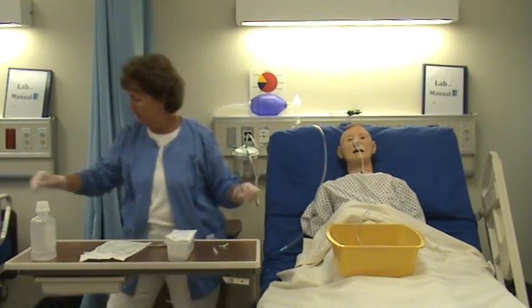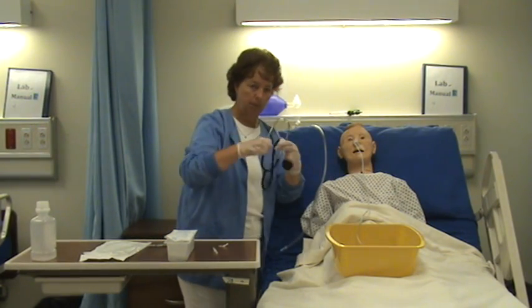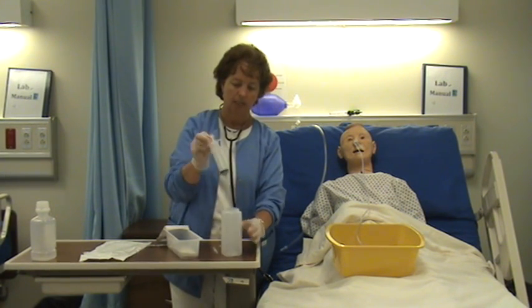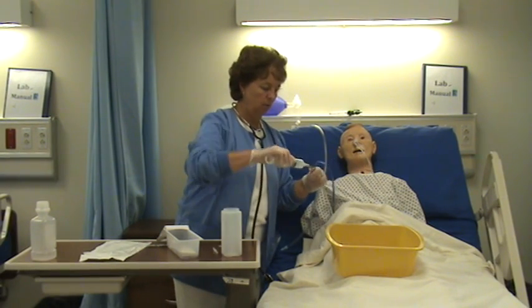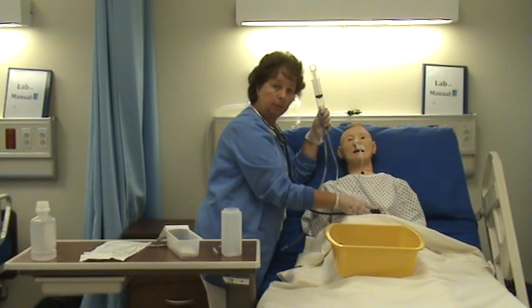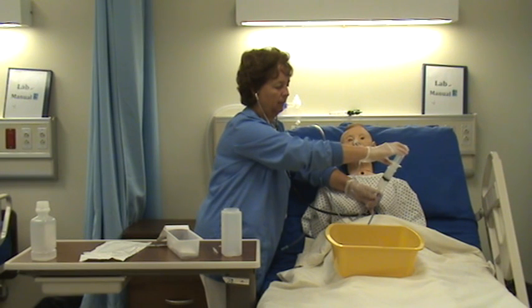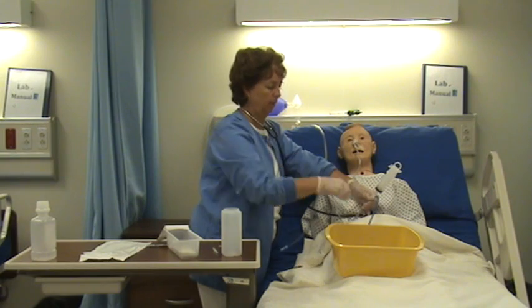Now I want to check that the tube is in the proper place. The two methods are called auscultate and aspirate. I take my stethoscope and irrigation syringe and inject about 20 to 30 milliliters of air into the NG tube while listening over the stomach region — the upper left area. As I inject, I hear the air, and that's one way of verifying placement.